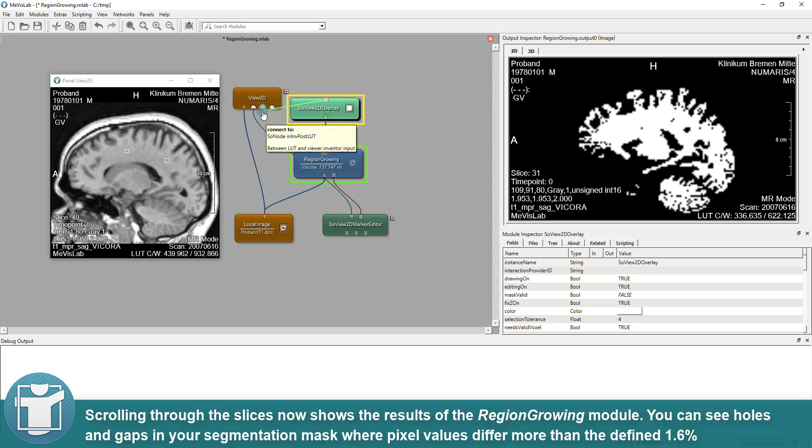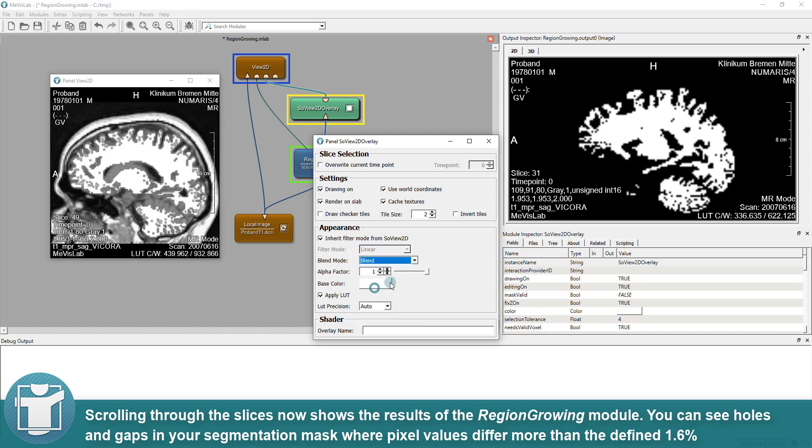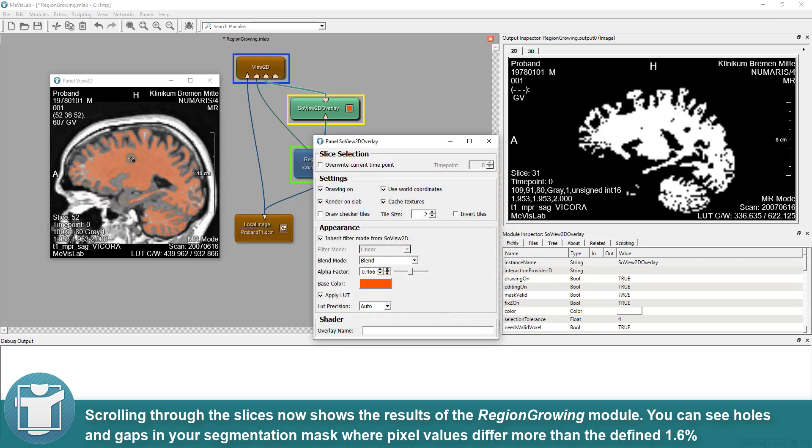Scrolling through the slices now shows the results of the region-growing module. You can see a lot of holes and gaps in your segmentation masks where pixel values differ more than the defined 1.6%.